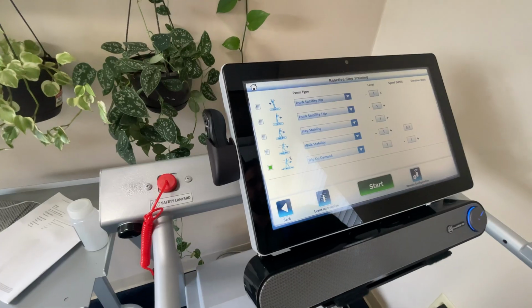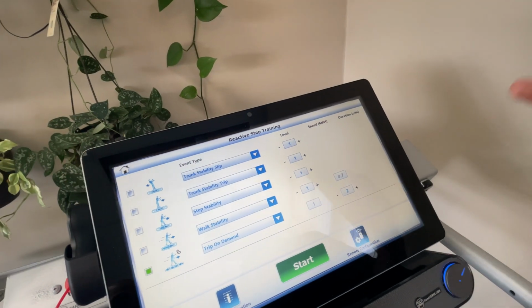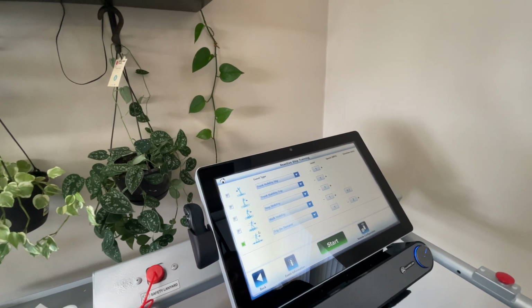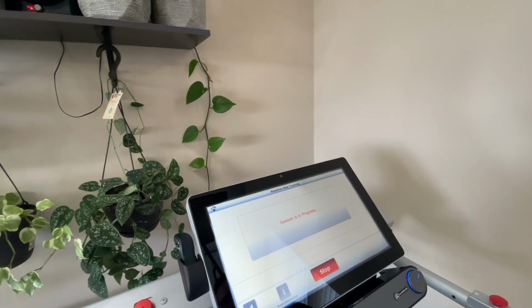Tony's going to really put me through the paces here, and we're going to bump up the speed to 2 miles an hour, which is the max speed that it can go, because a lot of published research shows that this is the best speed at which to induce that trip on demand. So once that's all set up, we hit the start button. The session is in progress.